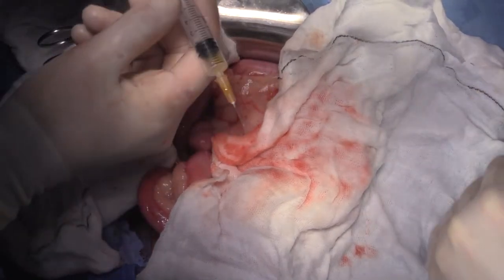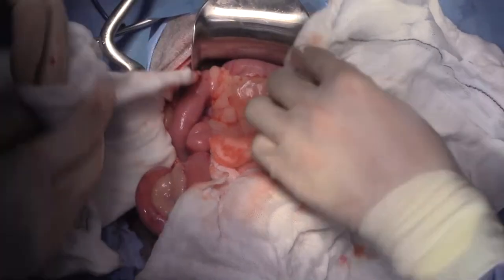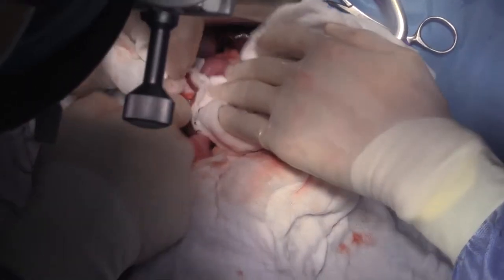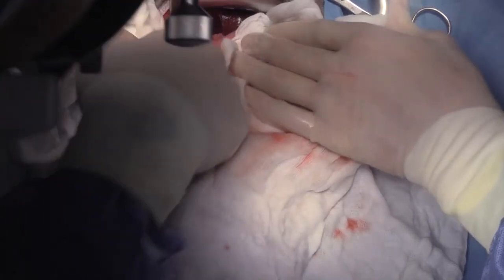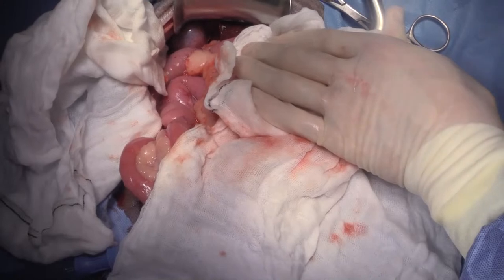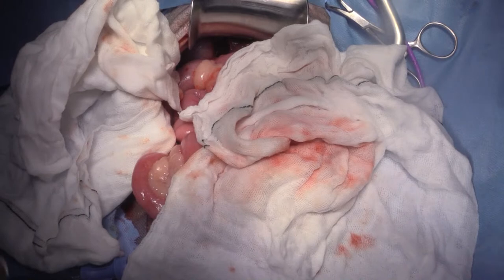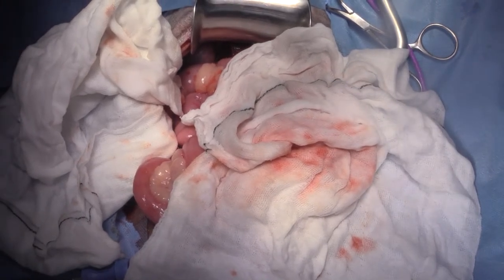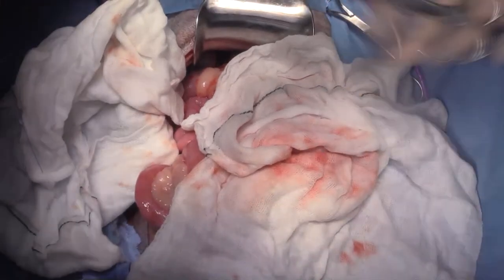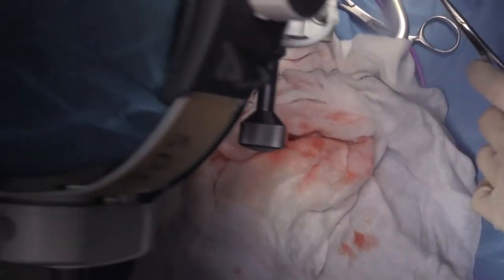And so based on that, I'm actually not going to do an enterotomy here to catheterize that common bile duct. I don't think we need to, based on the ultrasound findings and also what we saw just now in surgery. So I'm going to focus on this gallbladder and getting this thing out. Can I get, please, some number 3-0 PDS swaged needle? I've already got some. Perfect. Thanks, Jeff. And so I'm just going to put a cruciate suture into the apex of the gallbladder. It's going to act like a little handle for me to retract on it and then help us with our dissection.